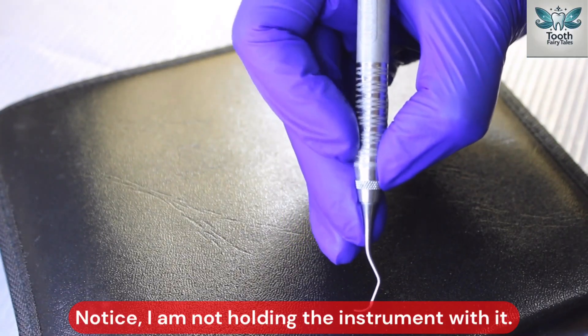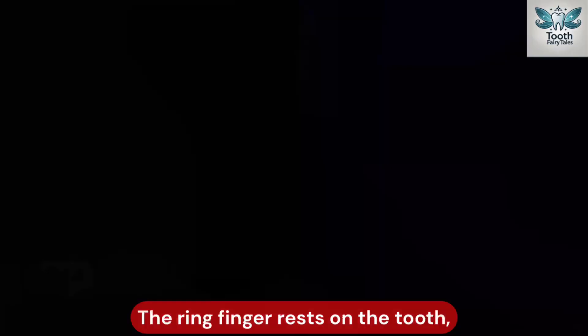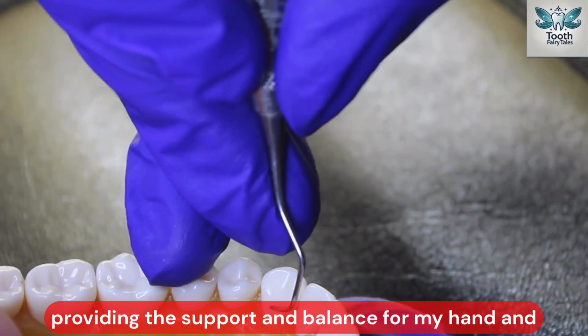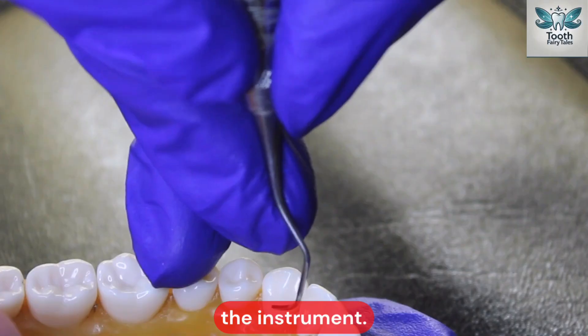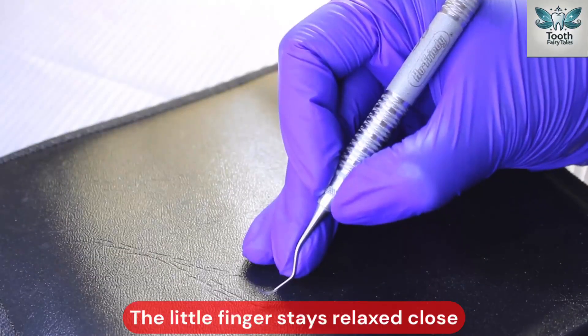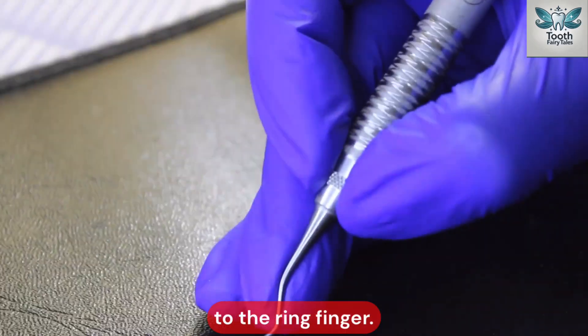I am not holding the instrument with the middle finger — I am just resting it. The ring finger rests on the tooth, providing support and balance for my hand and the instrument. See how it acts like a stabilizer. The little finger stays relaxed, close to the ring finger.